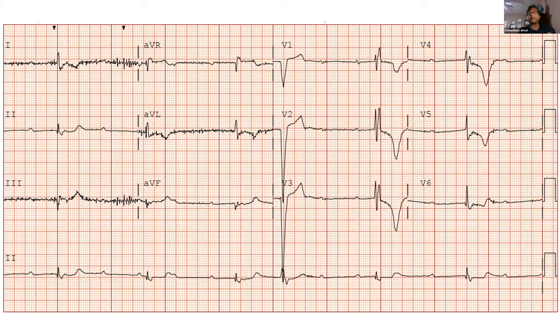And now you look at the association. The P and QRS, there is no association. It is totally dissociation. So atrial rate higher, ventricular rate lower, and there is AV dissociation. So this is complete heart block.